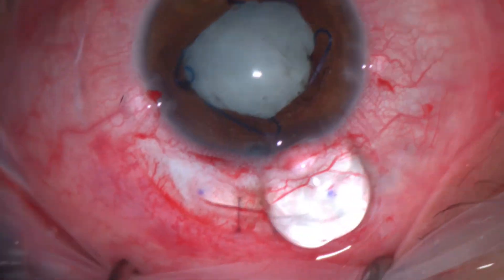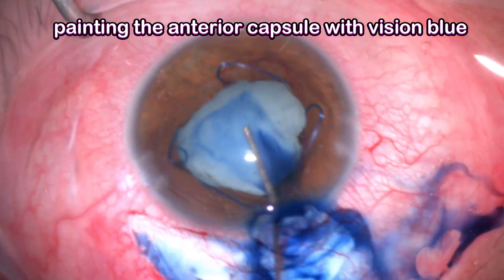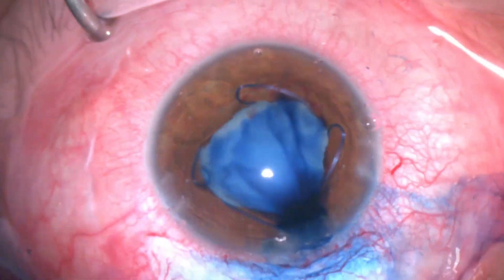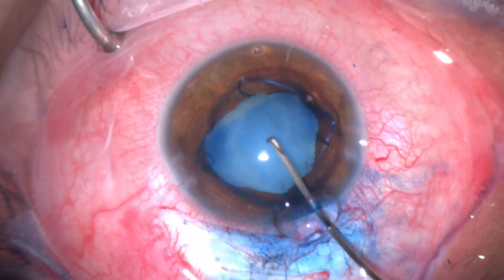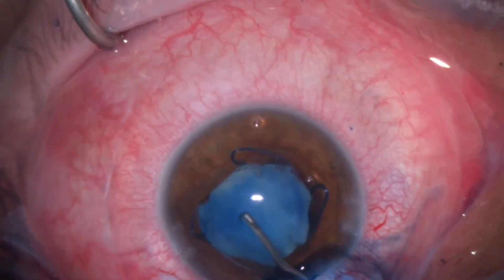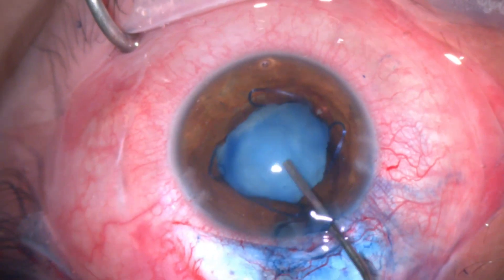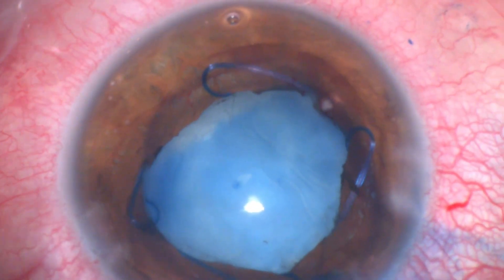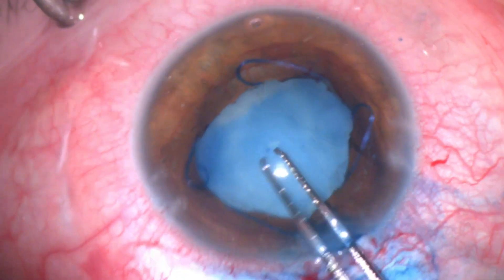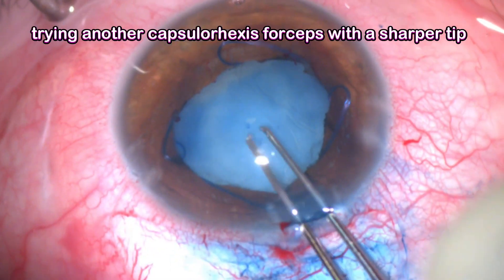After centering the Malyugin ring and injecting extra viscoelastic, I stained the anterior capsule with Vision Blue, then started the capsulorrhexis using a cystotome. When I tried to open the capsule I found there was severe zonular weakness. I managed to make a small snip in the anterior capsule.